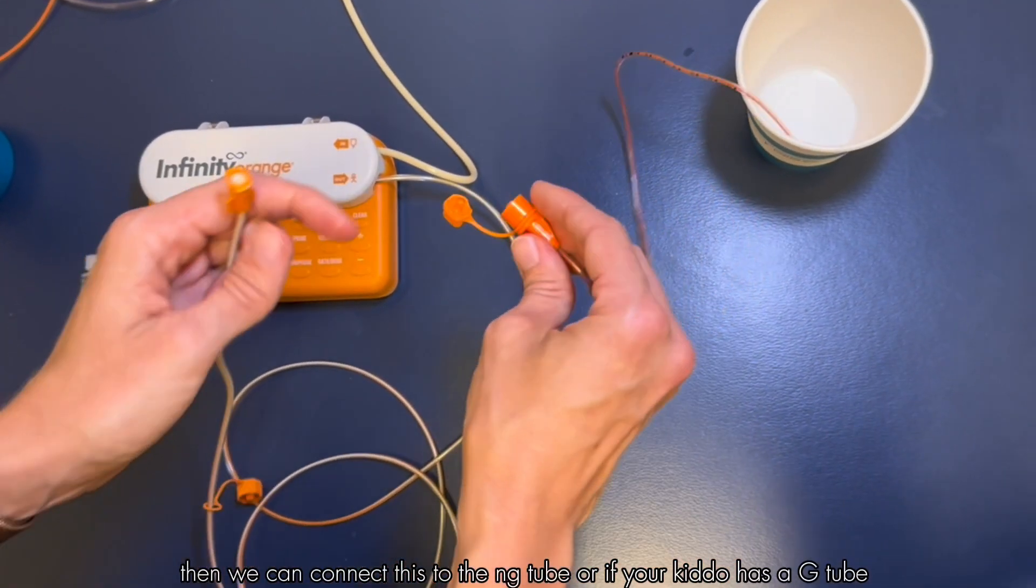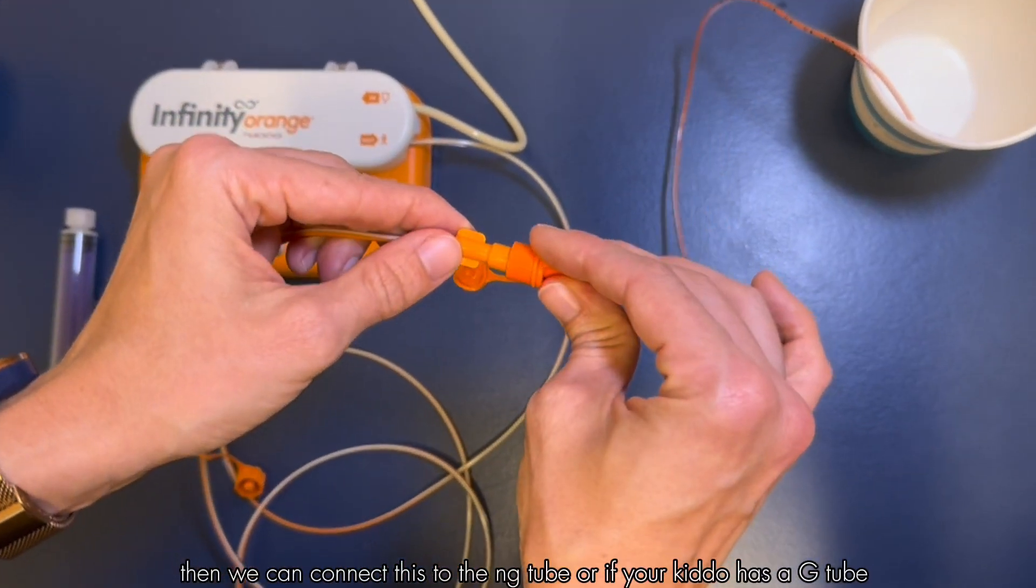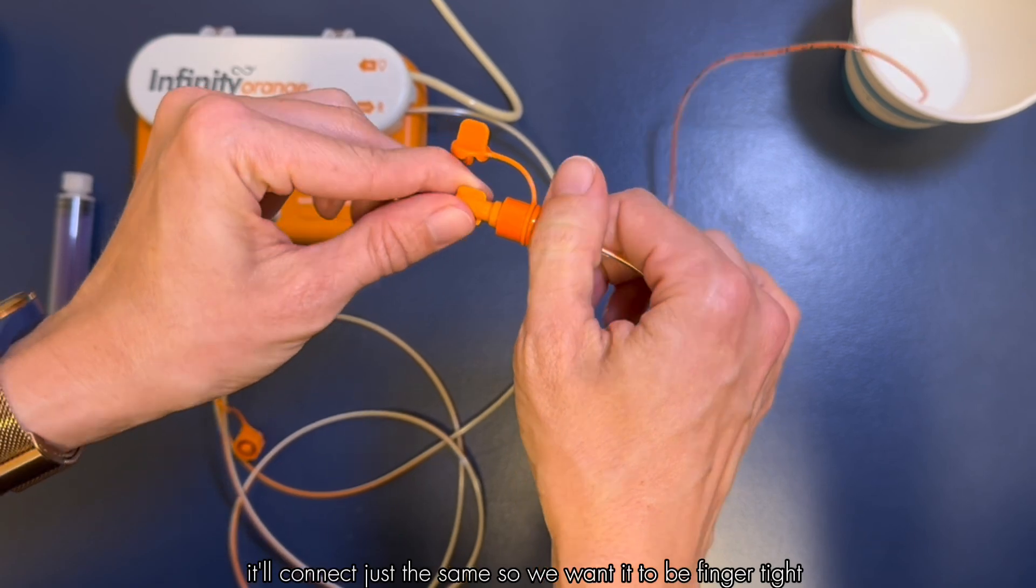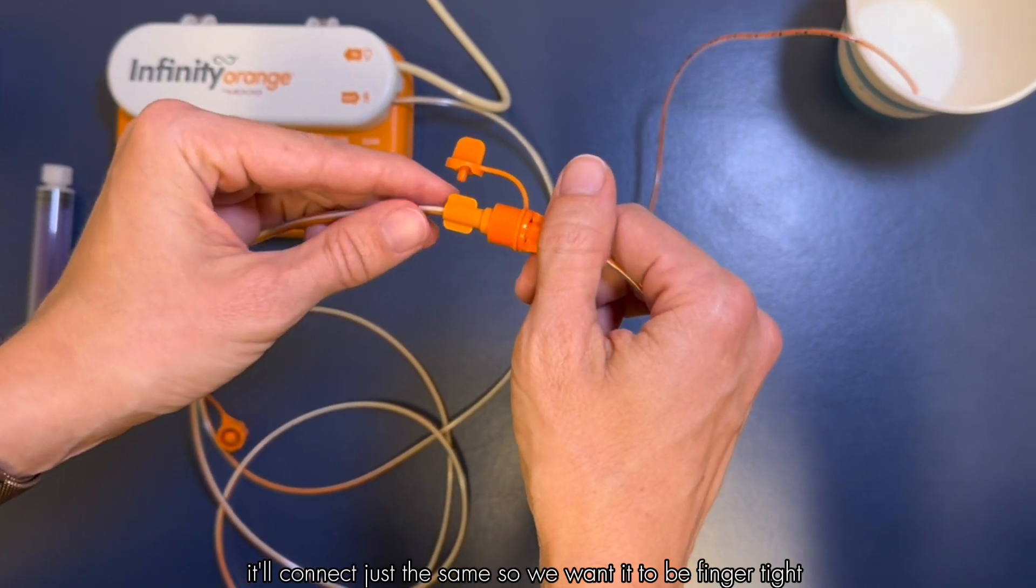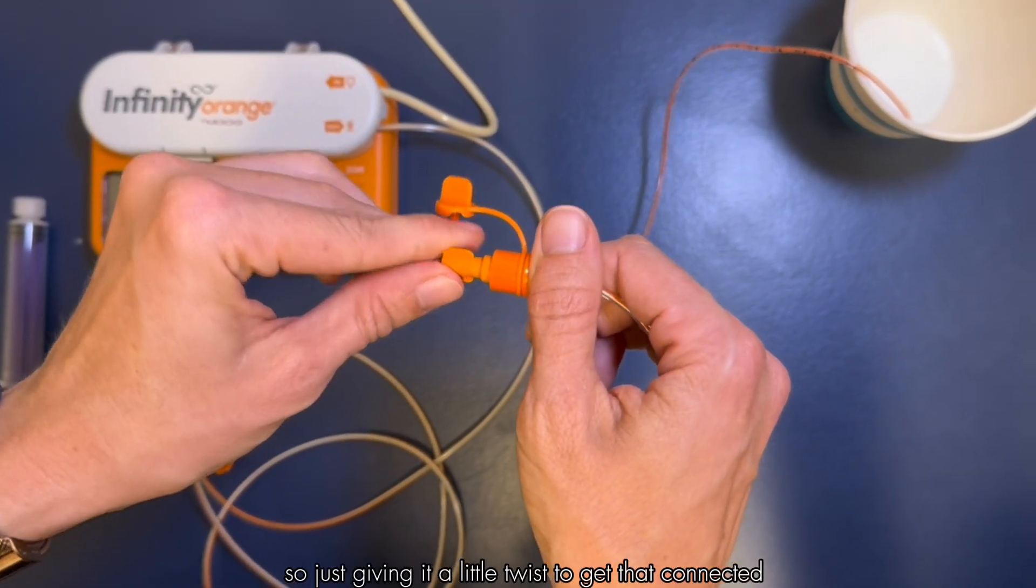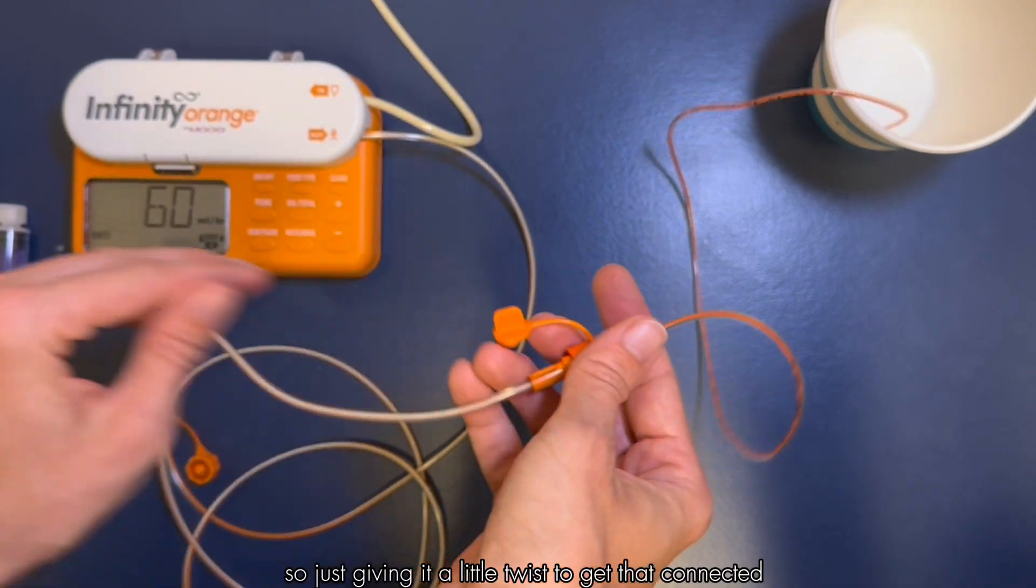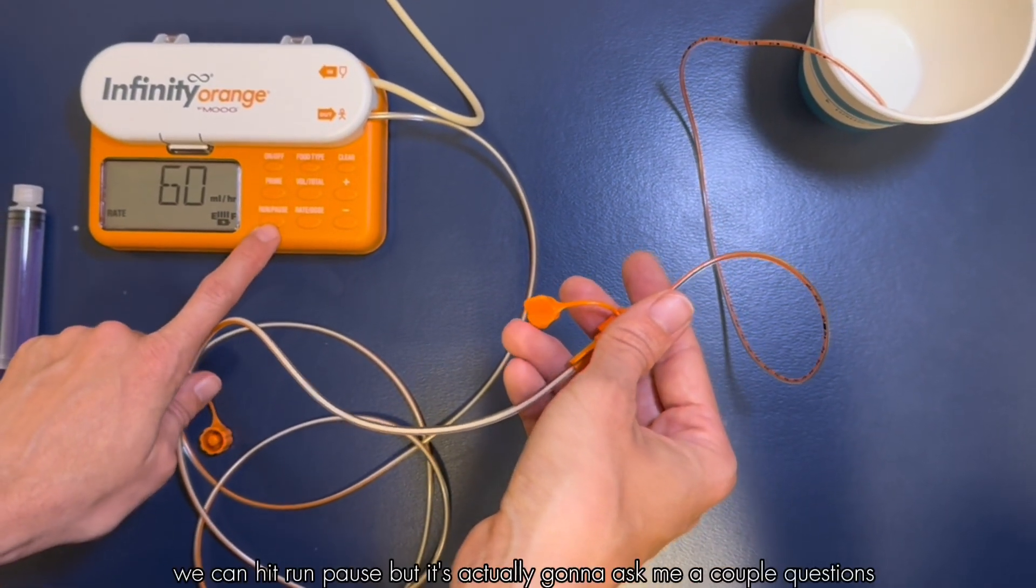Then we can connect this to the NG tube or if your kiddo has a G tube it'll connect just the same. We want it to be finger tight, just giving it a little twist to get that connected. And then to start the tube feeding we can hit run pause.